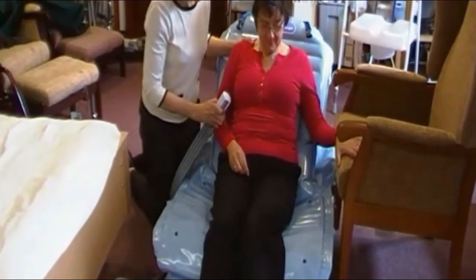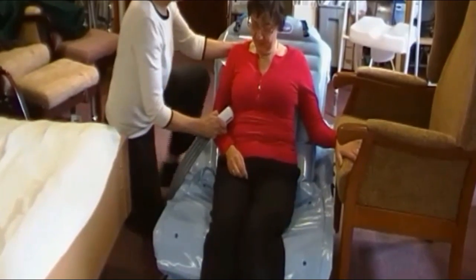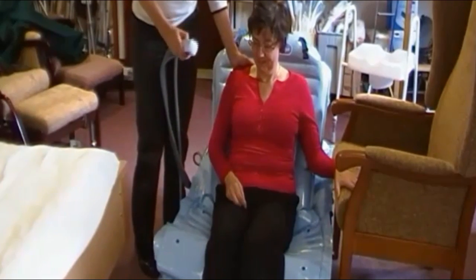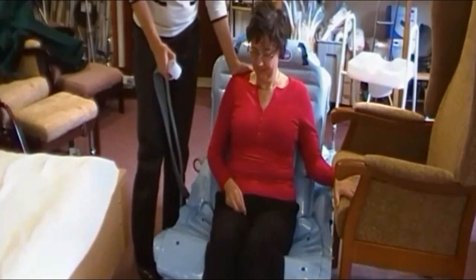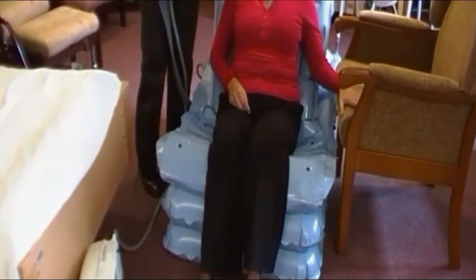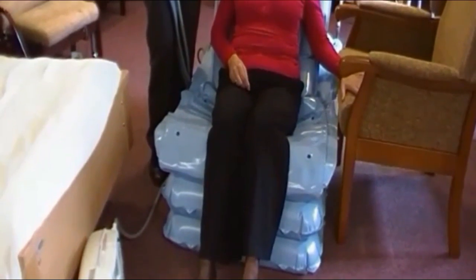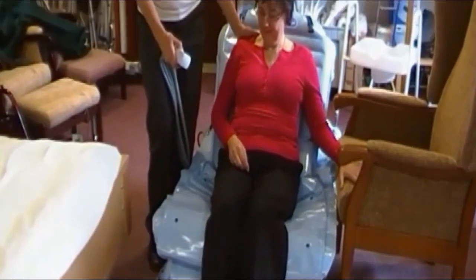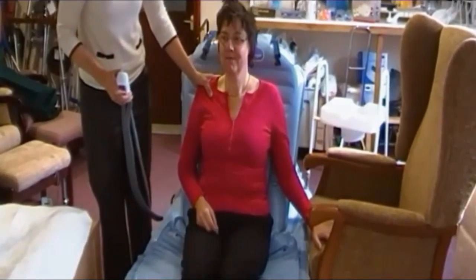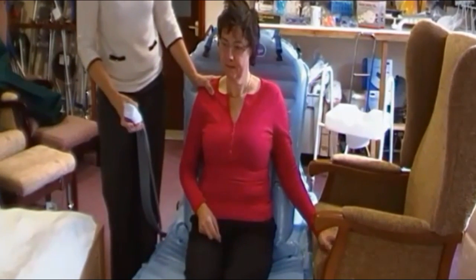Okay. And as we come up to the third cushion, to stand to support her. This product will lift somebody up to 50 stone quite successfully. It's used a lot in America. We'll sit you right up. I think you're high enough to stand. The cushion will lift a little higher.